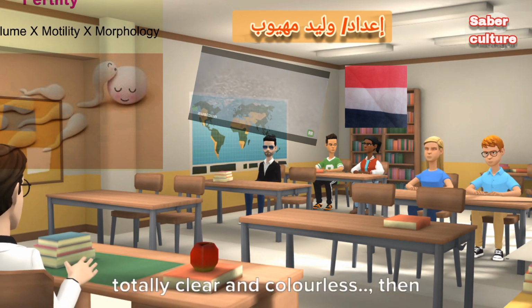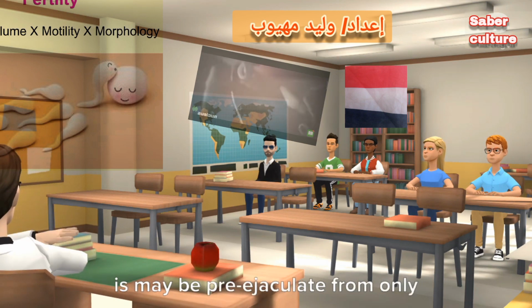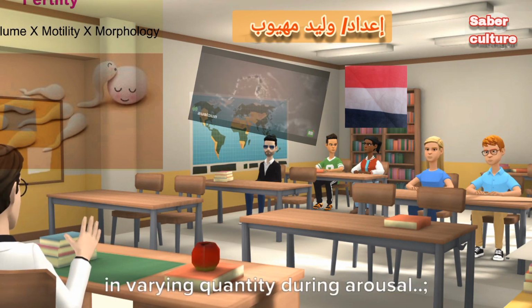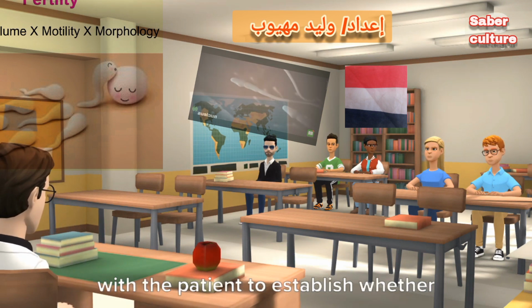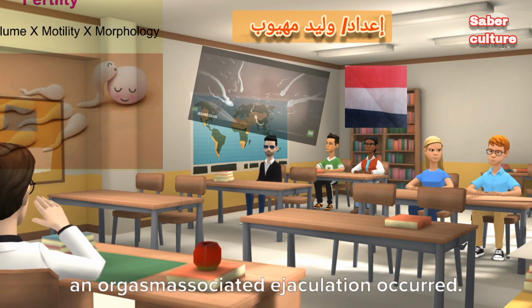If the ejaculate appears viscous, totally clear and colorless, then this may be pre-ejaculate from only the Cowper's glands, which men produce in varying quantity during arousal. In this scenario, this should be discussed with the patient to establish whether an orgasm-associated ejaculation occurred.